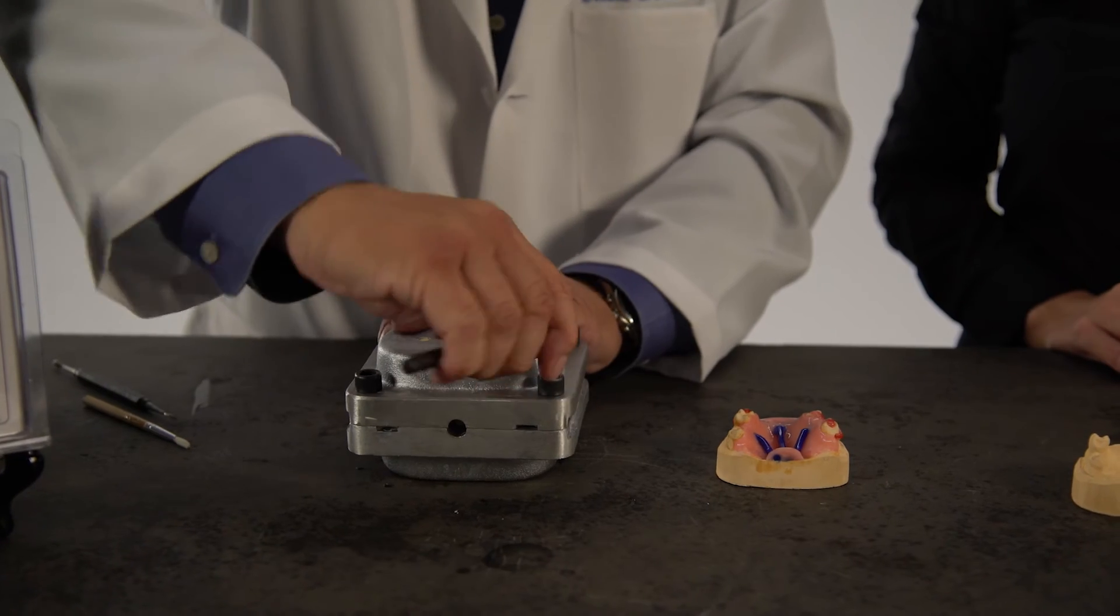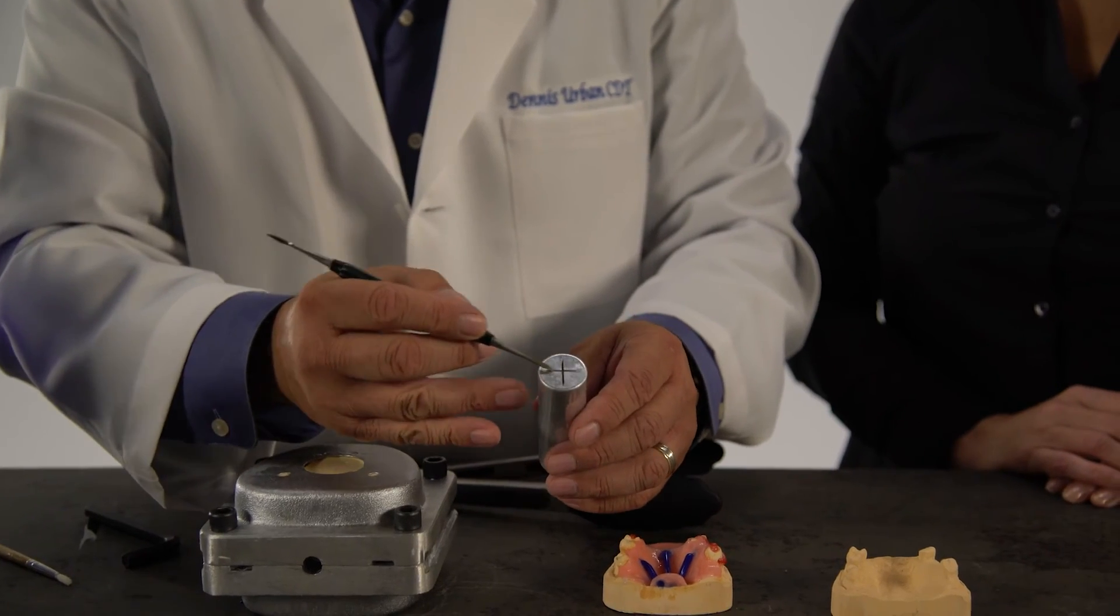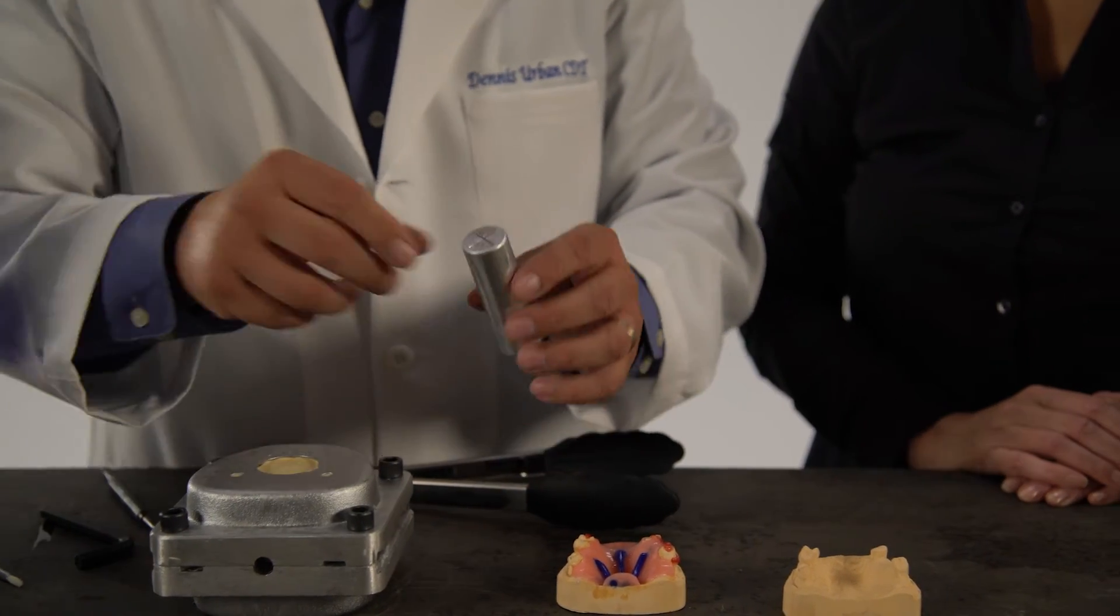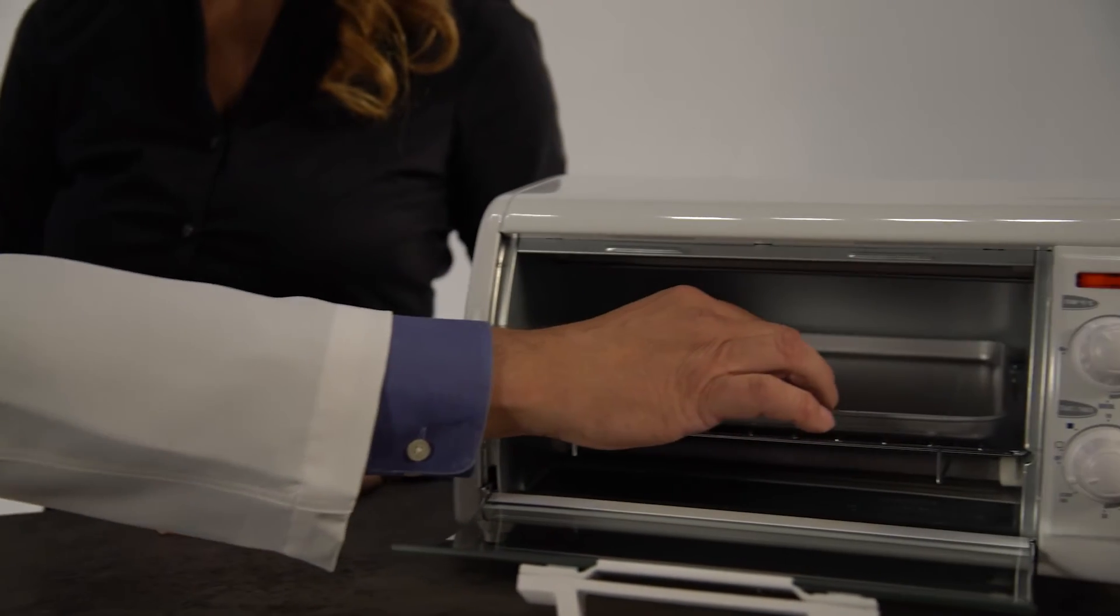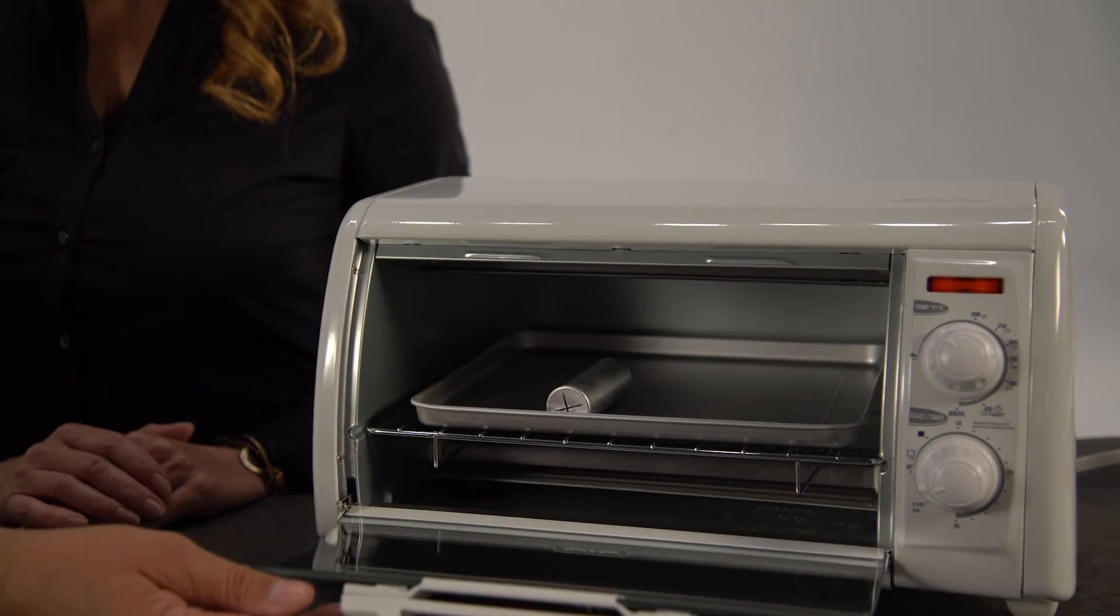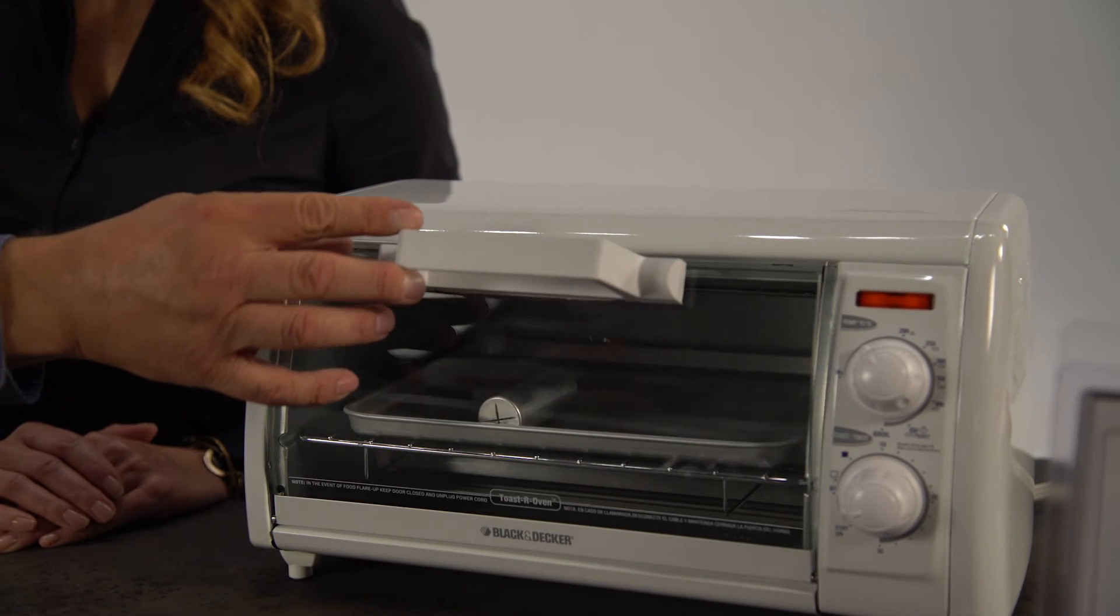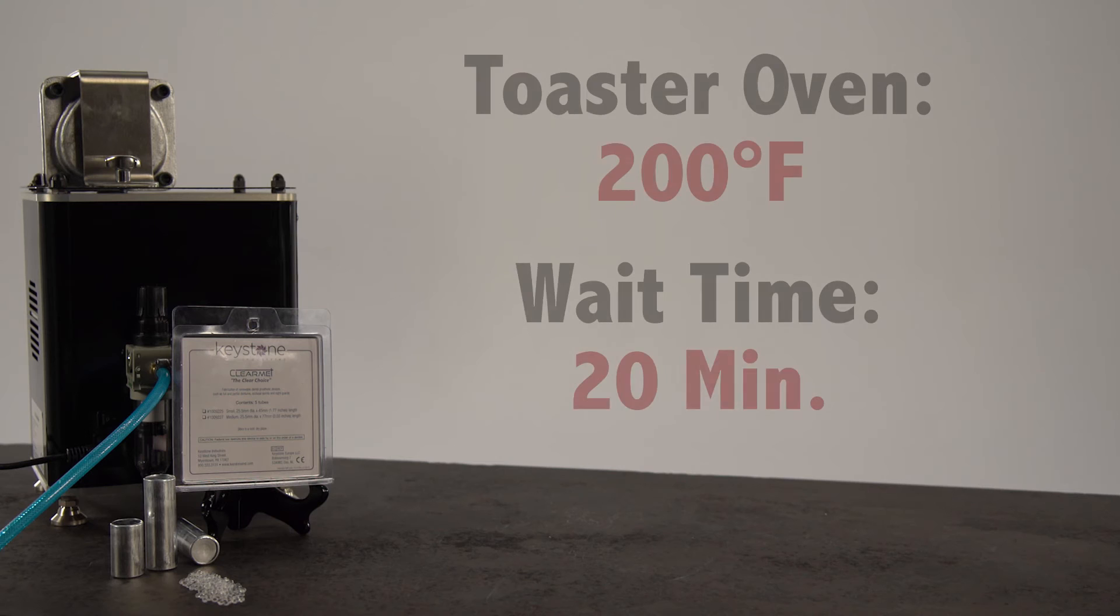While the FlexPress is heating up, take the clear mat tube and cut an X into the top solid section of the tube with a disc. Next place the tube under heat lamps or in a toaster oven for 20 minutes. The temperature of the toaster oven should be around 200 degrees Fahrenheit.